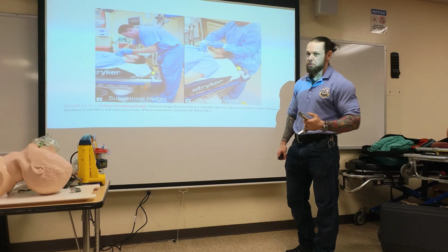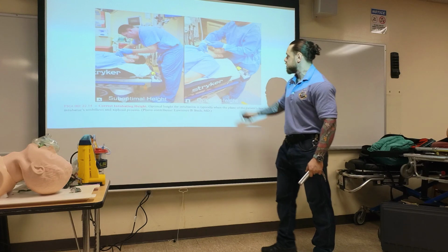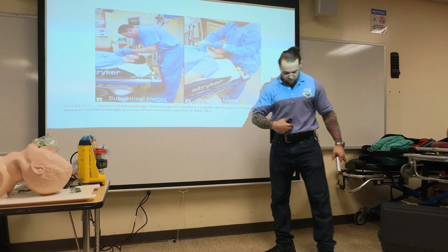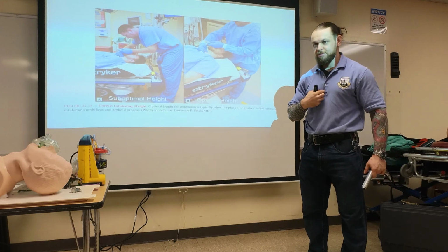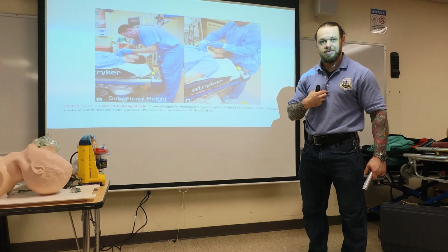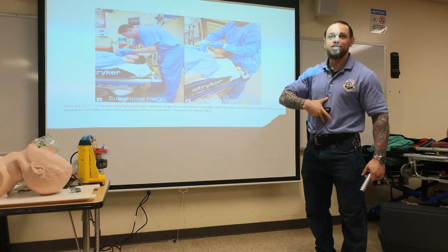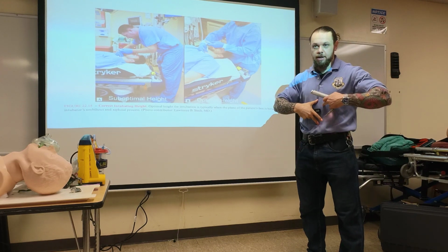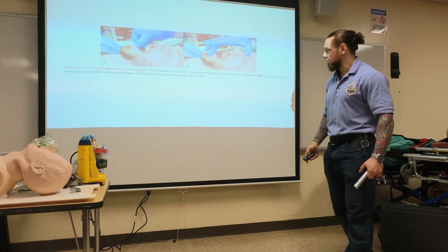Next thing, positioning. Ideally, in EMS, we don't always have this, but if they're in the back of the stretcher, you want to position so that their head is between your belly button and your xiphoid process. So the head is right here. If you're able to, pull up the stretcher, sometimes you can. You have to be in a lying position.